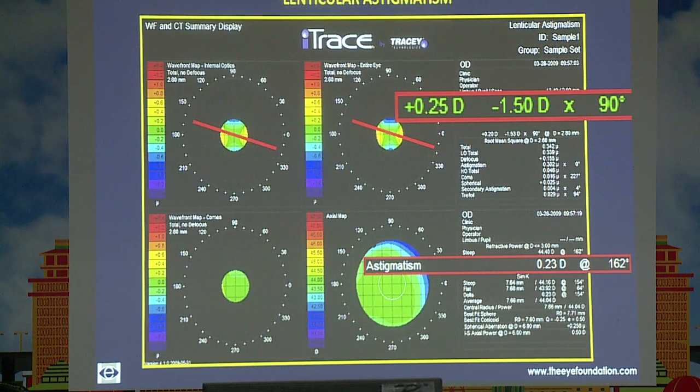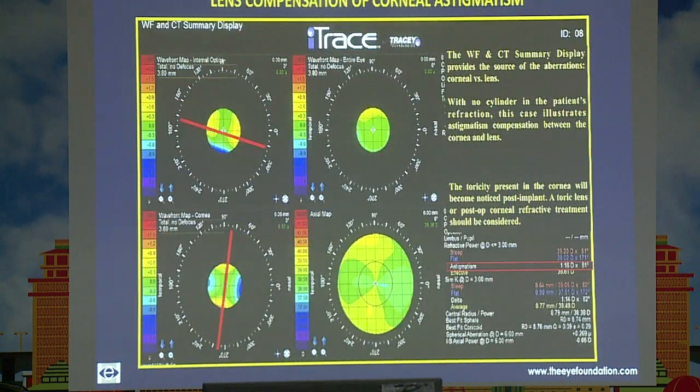Once this lens comes out, obviously the cornea itself is pristine. So even though the patient was having astigmatic power in his glasses right through, he is not a candidate for a toric intraocular lens.